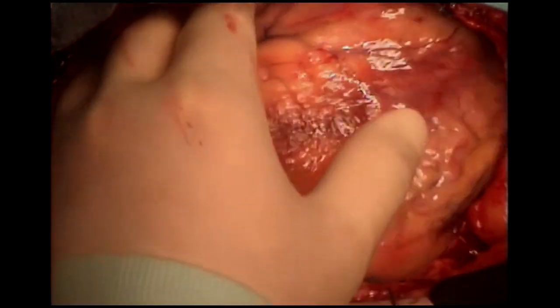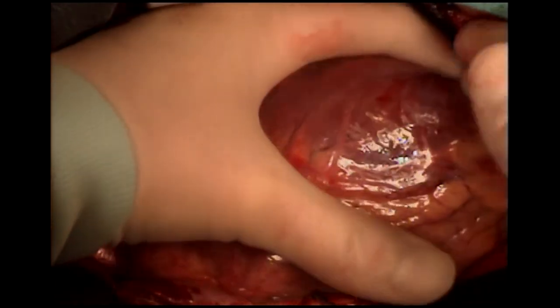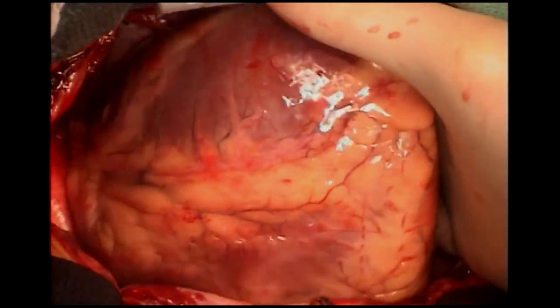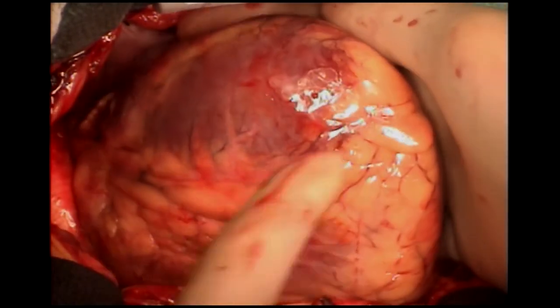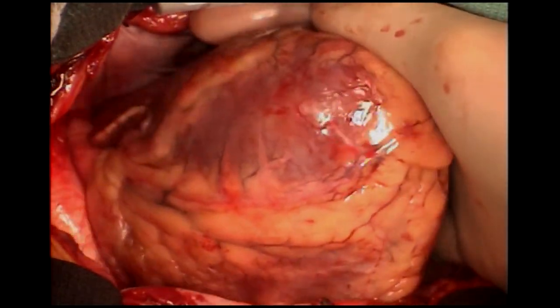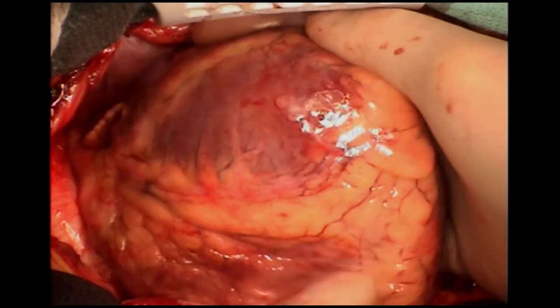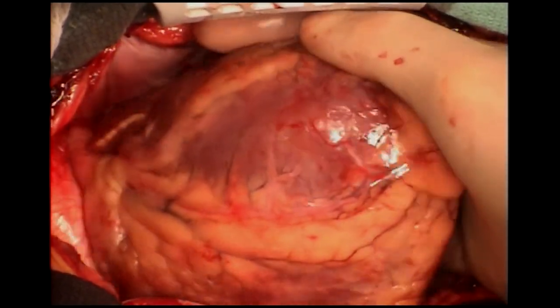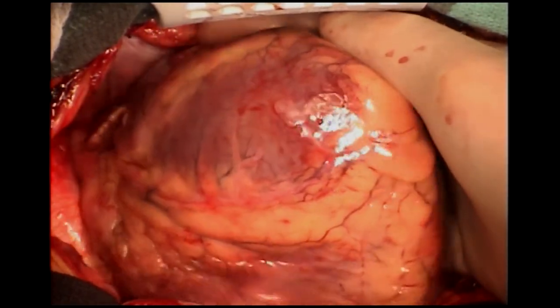This patient does not have a normal functioning heart. I'm going to lift the heart up now. You may begin to appreciate that the heart doesn't so much contract as twist upon itself — if you look at the apex. You'll notice how the heart contracts in itself, though it's not particularly well demonstrated in this heart because this is not a normal heart. It's very weak.